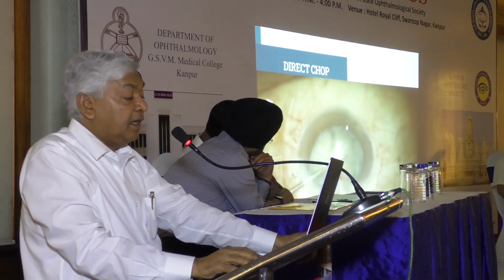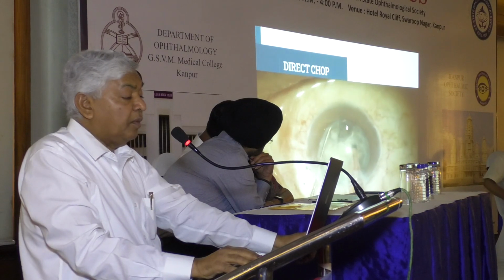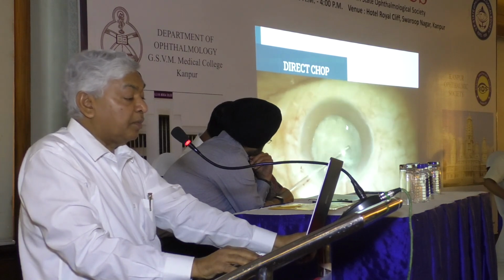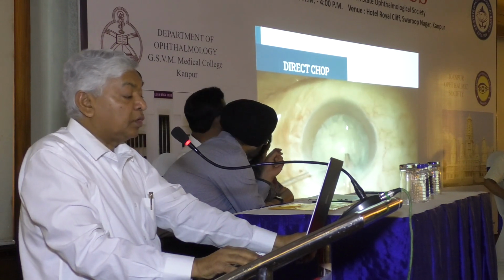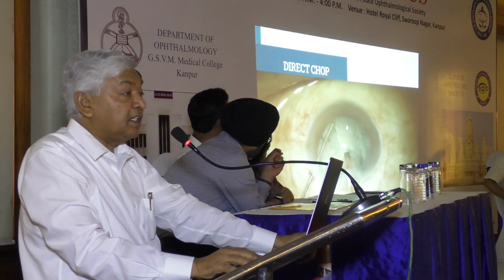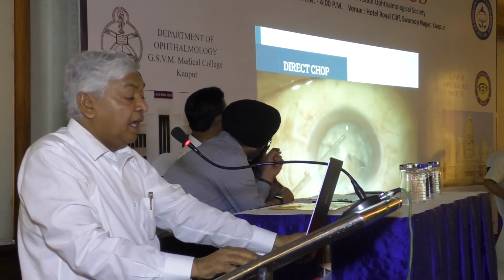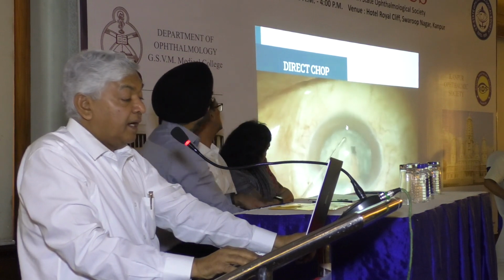You can see the nucleus in different pieces, in multiple pieces, and you only have to hold it. You should remember the ratio principle. If you hold it, the vacuum is very high, so the energy should also be high. Just hold it and use energy very well. If energy is less in this situation, what will happen? It will occlude and stop the nucleus from being removed.